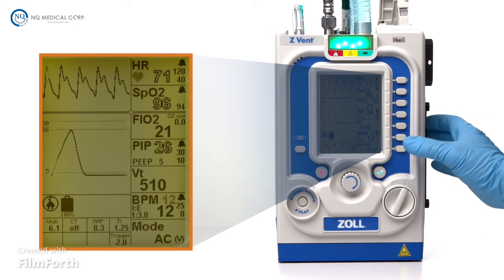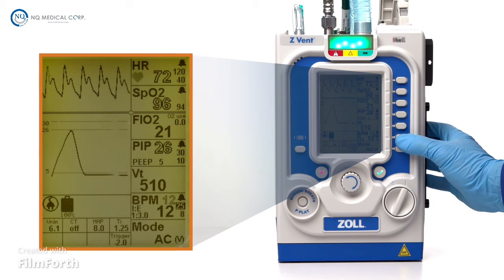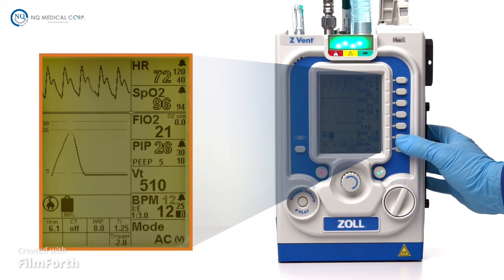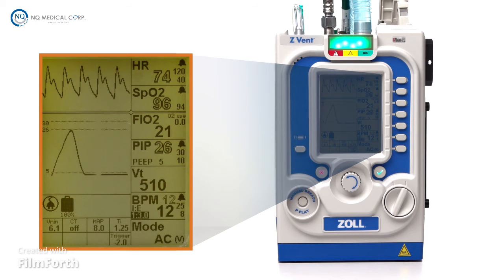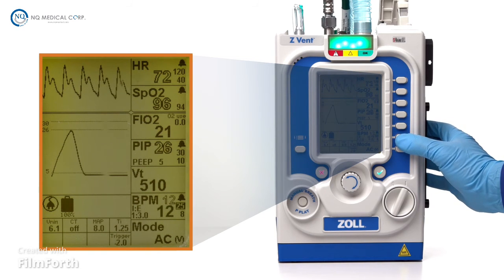Press the parameter button once to change the desired BPM, twice to change the high breath rate alarm, 3 times to change the low breath rate alarm, and 4 times to change the I/E ratio. If desired, the user may inverse the I/E ratio. To do so, press the parameter button 4 times to cycle to the I/E ratio value.